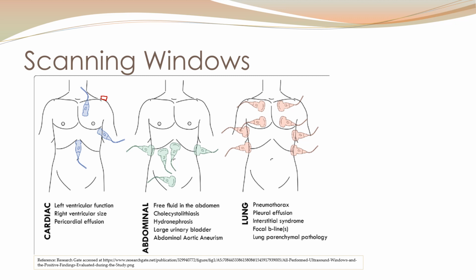You can check the pericolic gutters for any free fluid by just looking carefully in each of the quadrants. Check the bladder in the center and then this quadrant, and then you can access the tail of your pancreas, your left kidney, your spleen, all over here by this window.